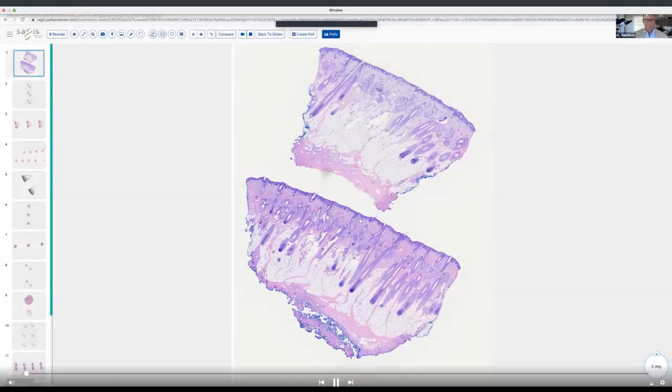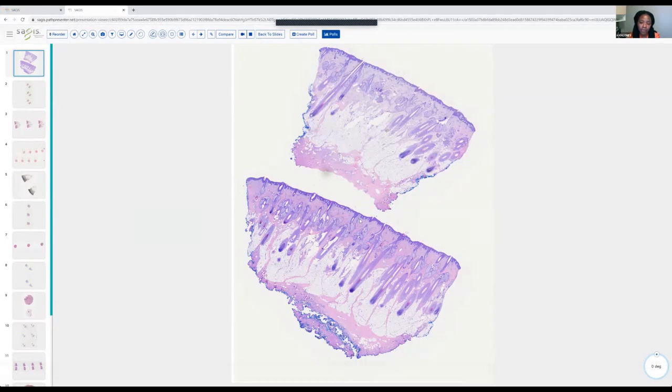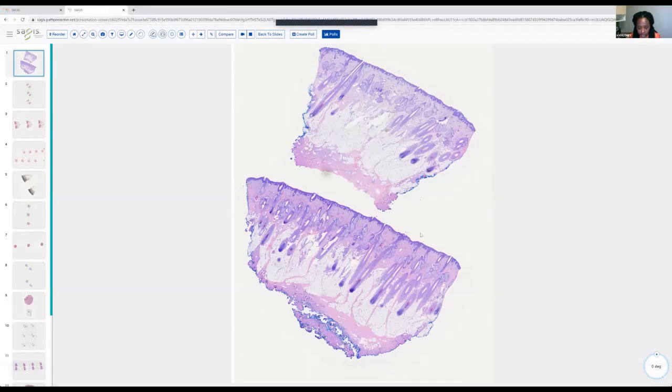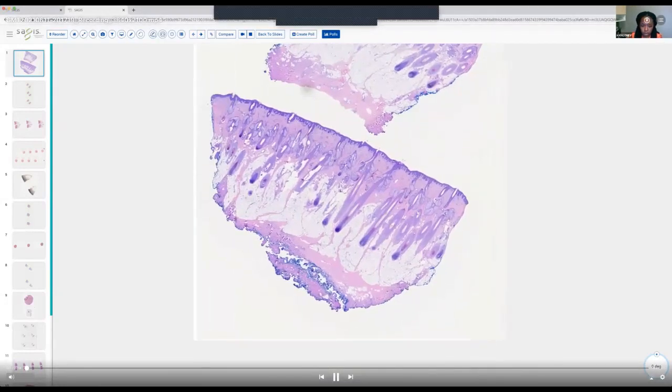Thank you. So yes, I'm Kuda Maloney, and I'm really quite excited to be sharing with you some insights on alopecia. For any good discussion about alopecia, we really want to feel comfortable with what normal scalp looks like first. Here we have a specimen from the scalp of a 31-year-old male. What you appreciate, even just at low power, is the following.